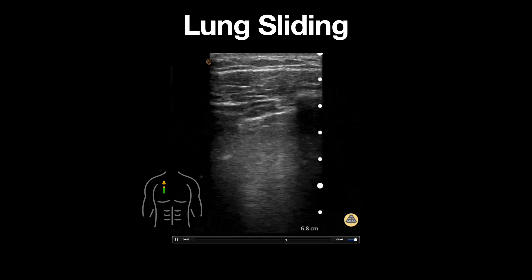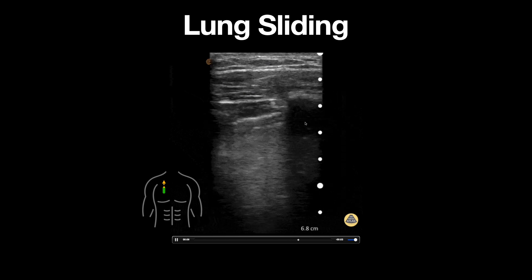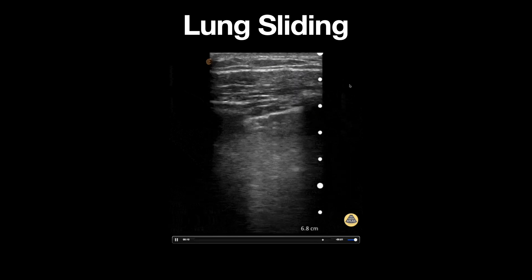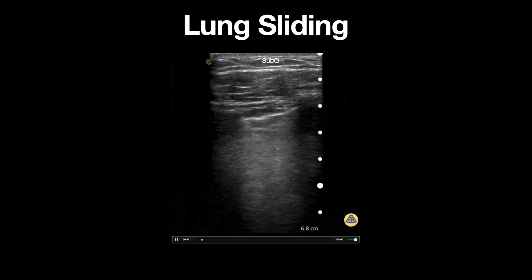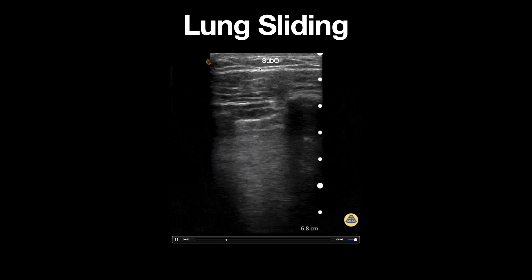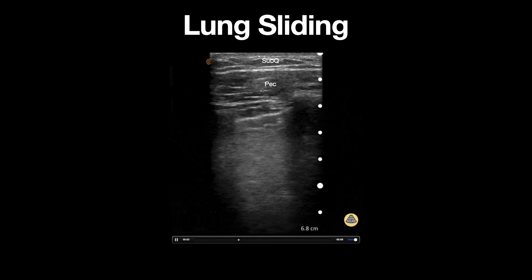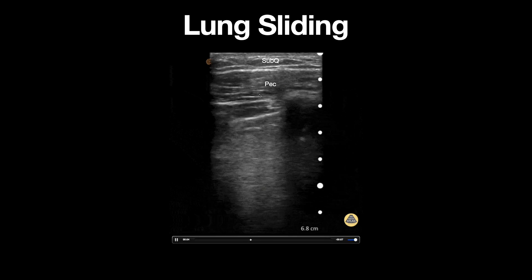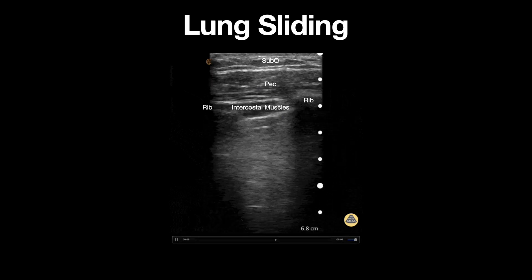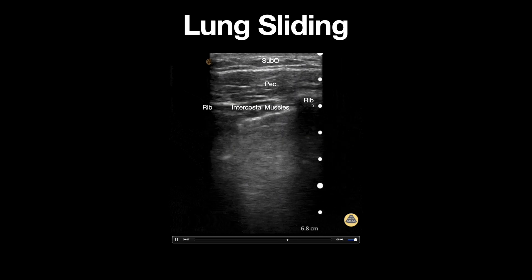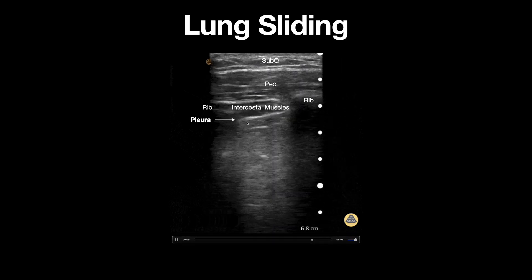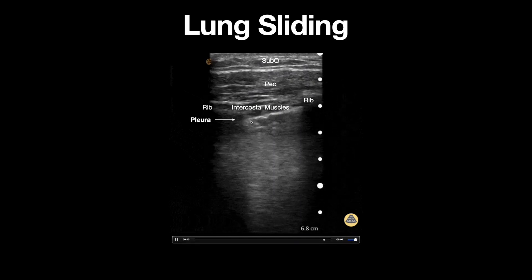We can appreciate the following structures in this image from top to bottom: the subcutaneous tissue, pectoralis muscle, intercostal muscles, ribs on both sides of the image, as well as the pleural line.